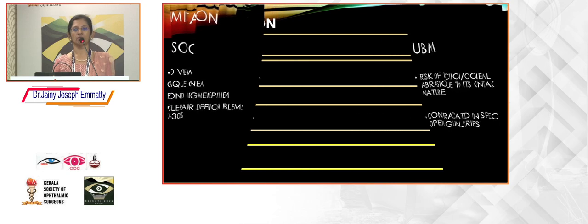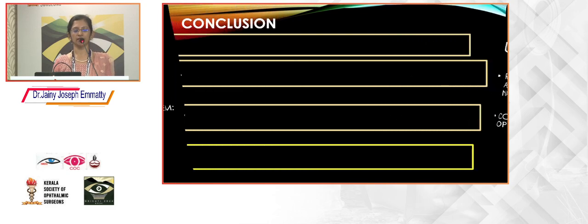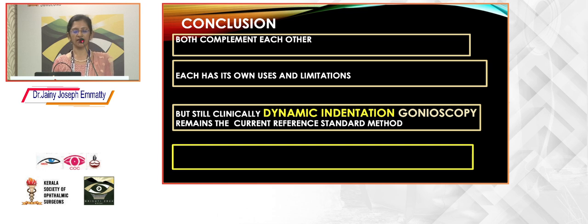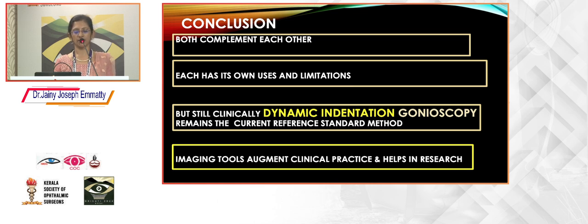I will conclude that the other sections will enlighten you more about these devices. My conclusion is that both complement each other, each has its own uses and its own limitations, but still dynamic indentation gonioscopy is our clinical reference standard method, and these tools will augment our practice and help in research. Thank you.